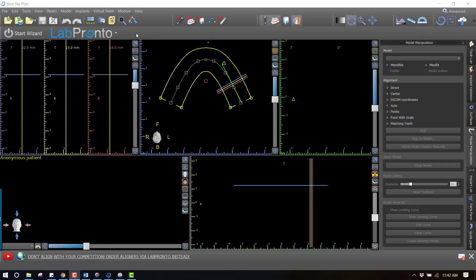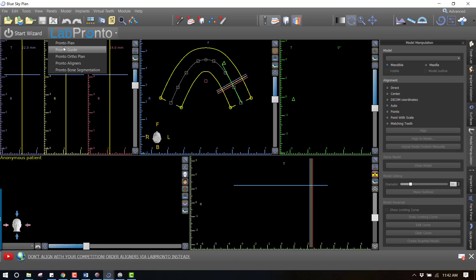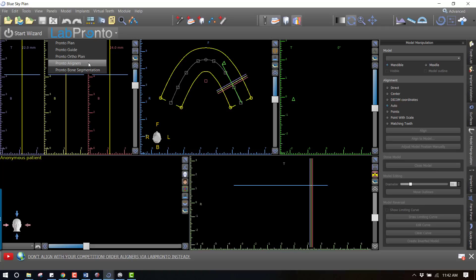I've just opened Blue Sky Plan and I'm going to come up here and click on Lab Pronto. The initial services that we are launching this with are surgical guide plans, and if you don't want to 3D print in-house you could also have the actual guide fabricated in addition to planned. Then also ortho plans - so if you're doing clear aligners and you don't want to take on the whole planning process yourself, you could outsource the orthodontic planning and even the fabrication of the aligners.